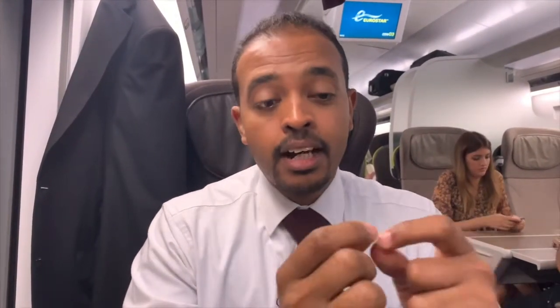What's tip number 2? Tip number 2 would be making sure that the center of the cornea is exactly in the center of the Invitria, because by that, as I said, you will make sure that many parameters are accounted for. Tip number 3, which I learned after I'd done a couple hundred injections when I first started, is that instead of using my fingers or a piece of gauze to retract the lids, I use a cotton bud, and by that I avoid touching the patient at all. So it's a completely non-touch technique.